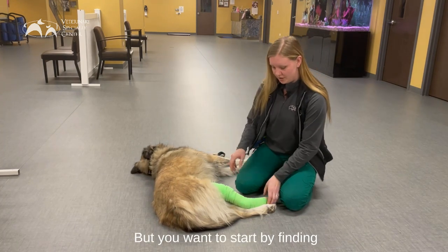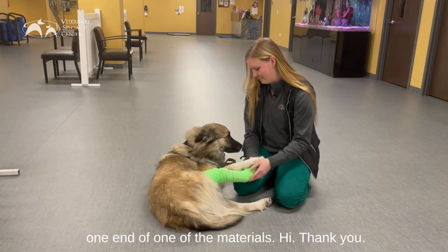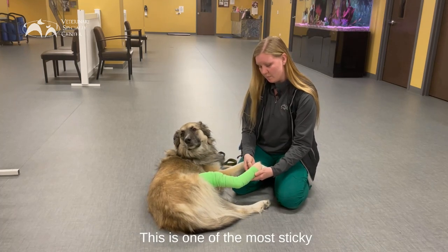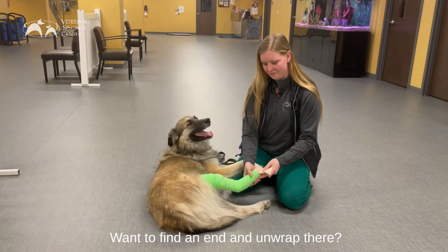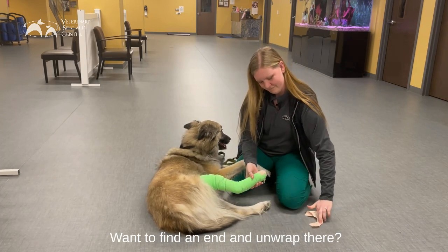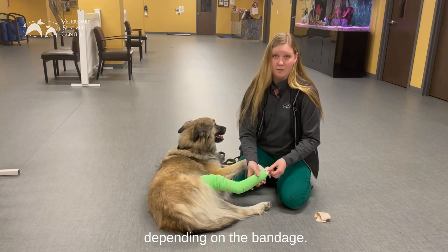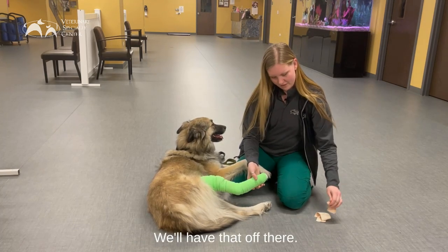You want to start by finding one end of one of the materials. This material at the bottom here is called elasticon. This is one of the most sticky and elastic parts of the bandage. You want to find an end and unwrap. There might be additional pieces depending on the bandage — every bandage is a little bit different.